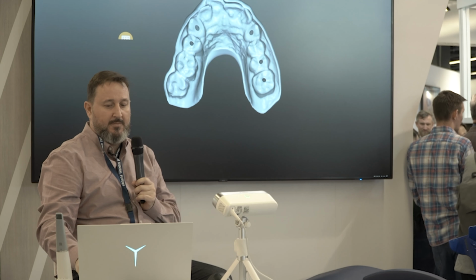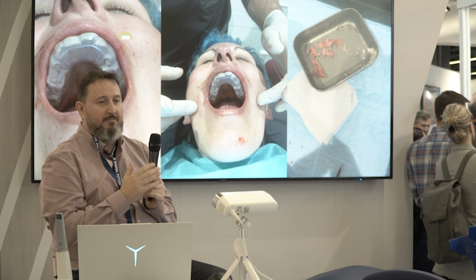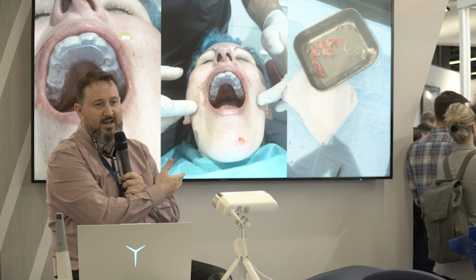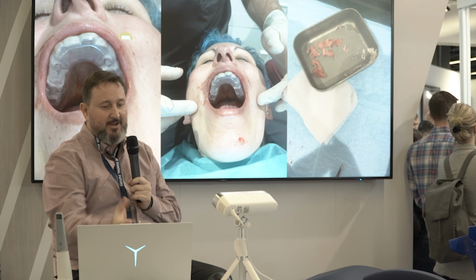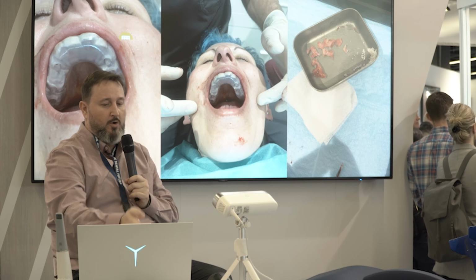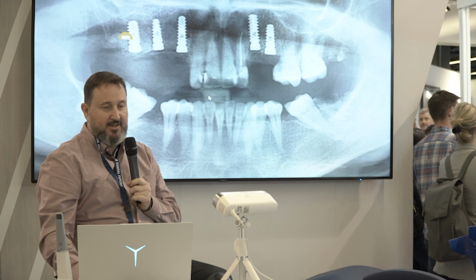Very easy. And then we place it in the mouth. This was a very short time. This was last week because it's a very new release. So here you can see the placement, the holes, and the bone that we take. The implants are placed, and next week we will place the lower part.